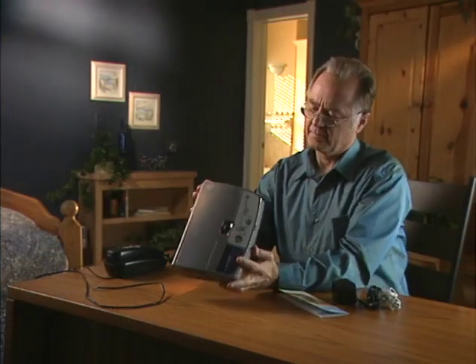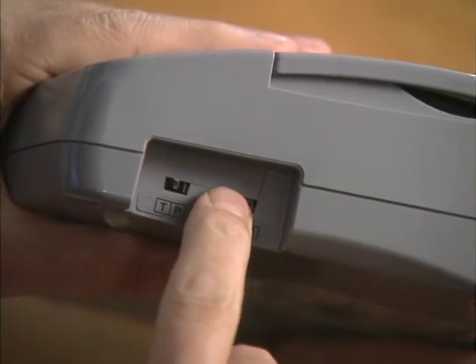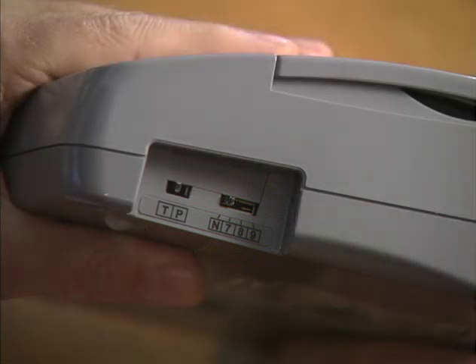Now look at the switches on the right side of the monitor. One switch is to select T tone or P pulse dialing. This must be set to match your telephone line. The most common setting is T or tone. However, check with your local telephone company if you're not sure whether your system is tone or pulse. The second switch is to select a number if you need to dial for an outside line. For typical home use, the second switch should be set to N or none. We'll talk about these settings later in the video.